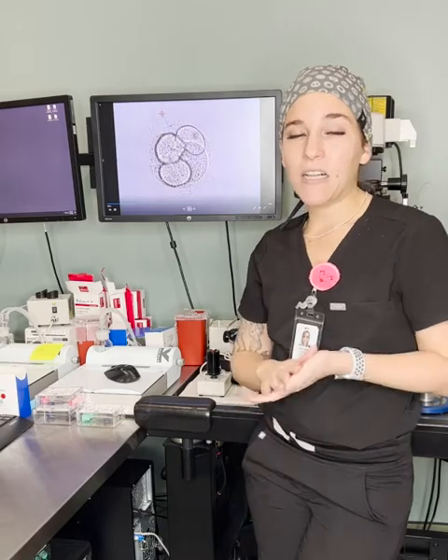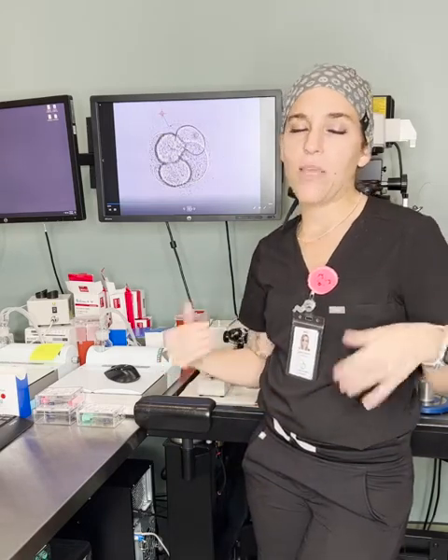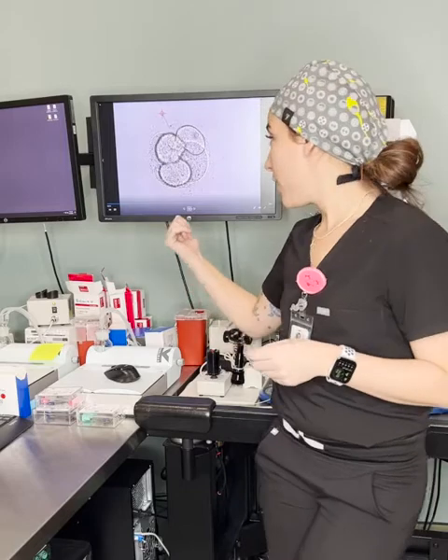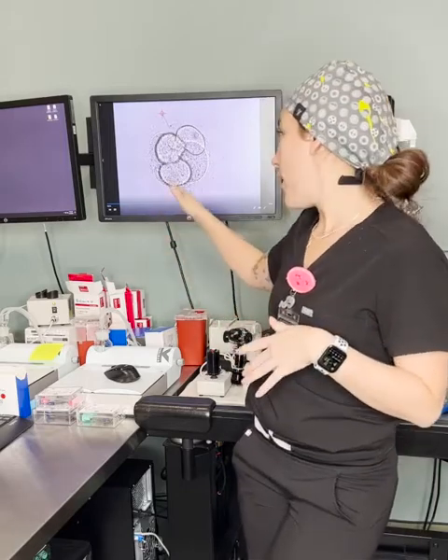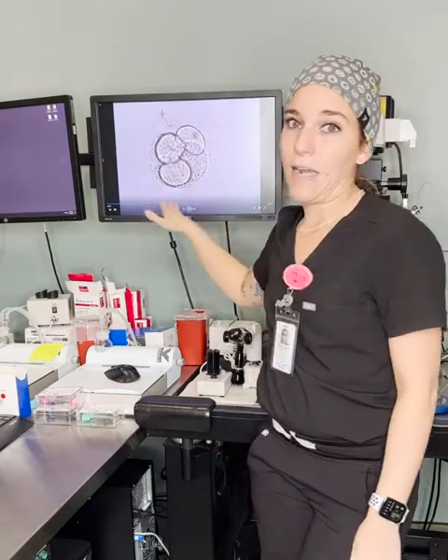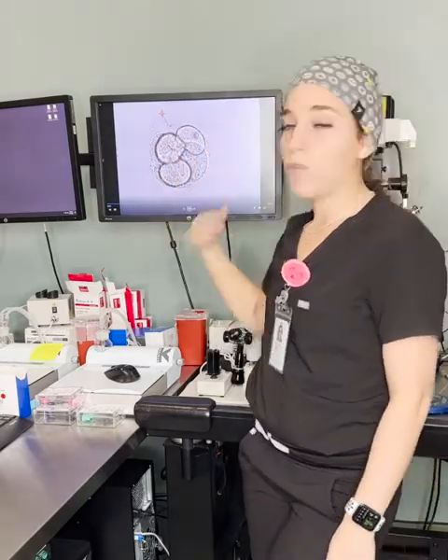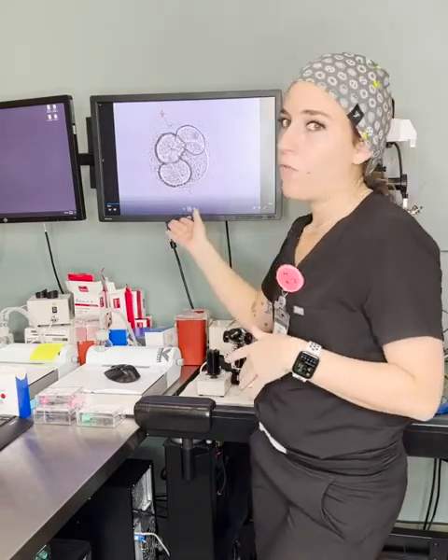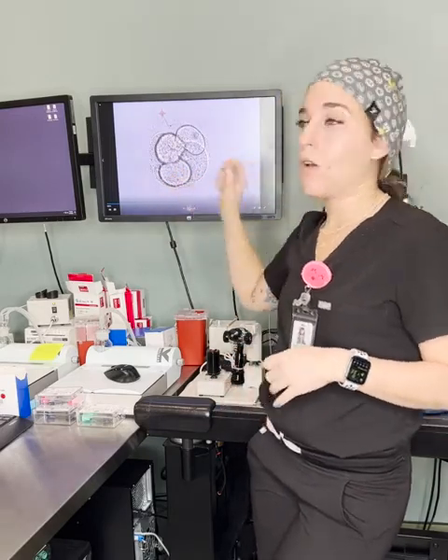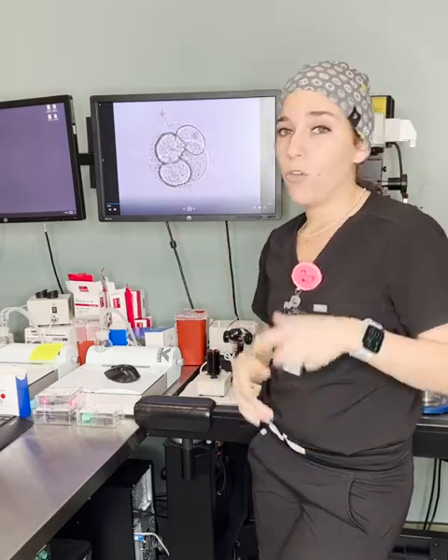I've seen ugly grade 3, the worst grade embryos, make beautiful blastocysts. Again, that's not always, but it is sometimes. I've seen beautiful, no fragmentation, not so symmetrical, but this embryo right here, 1, 2, 3, 4, 5, has about 6 cells that I could see just from looking at this. I do have to play with the focus in order to see the cells on the top and the bottom of the embryo. But again, this is already over 6 cells. It has virtually no fragmentation, and the cells are not symmetrical, so I wouldn't give this a grade 1. I would probably give this a 1.5 or 2, depending on what grading scale your lab uses.